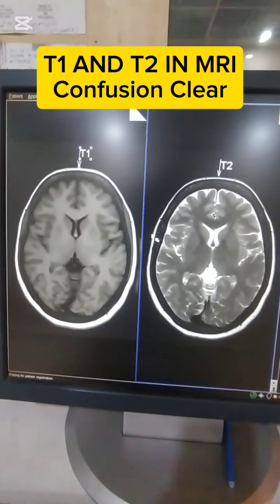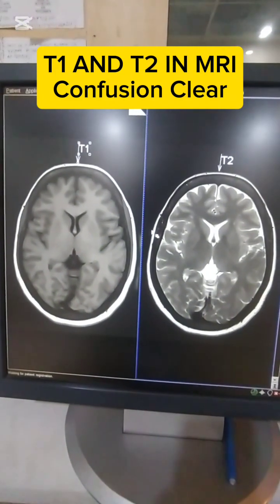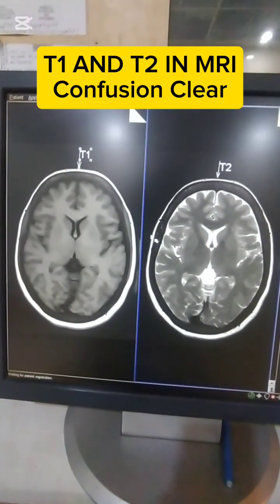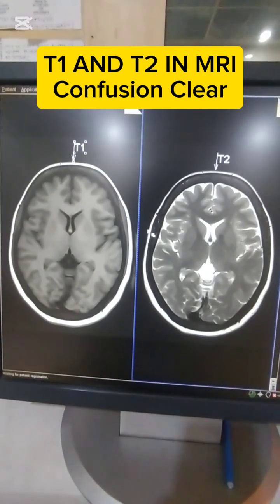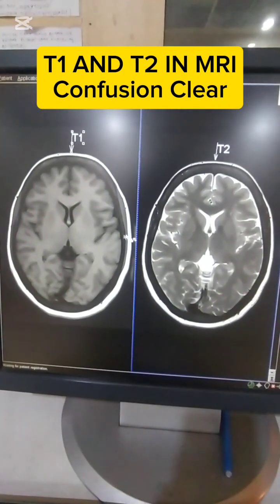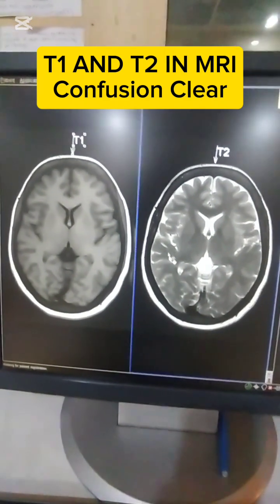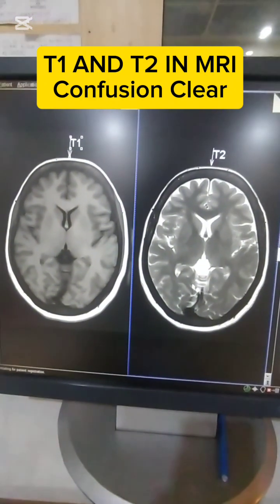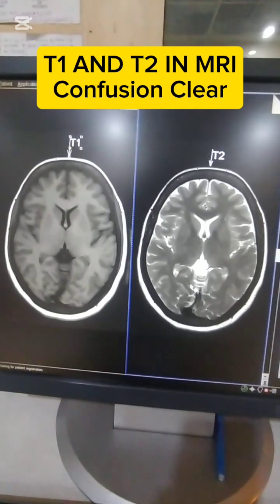So there are two things. One is that the protons are realigning with the external magnetic field, and the other process is that the protons are losing their phase coherence. I am not explaining the details of these two things. I think you have got an idea about T1 and T2. So thank you.